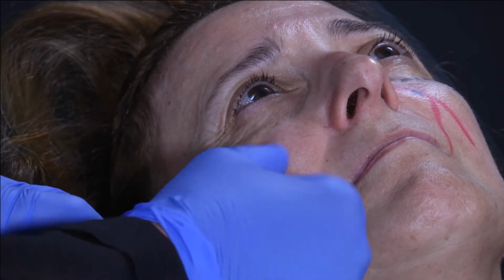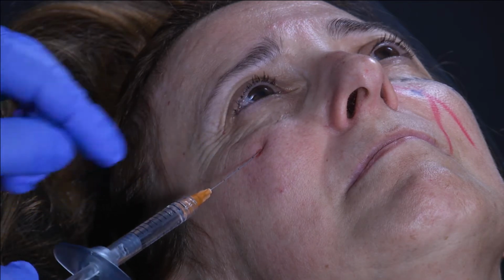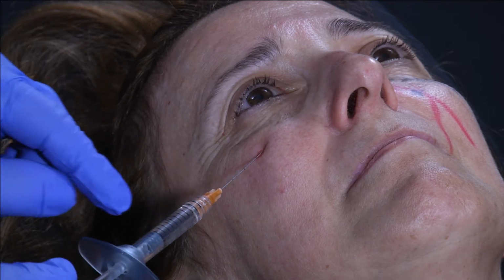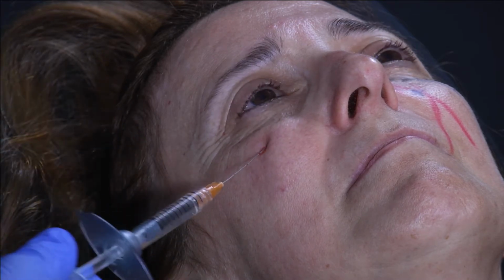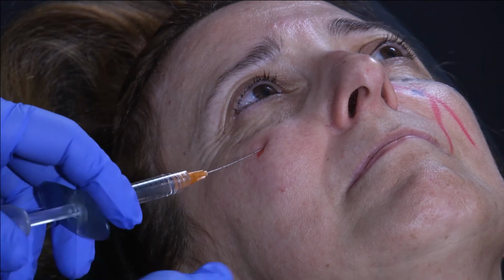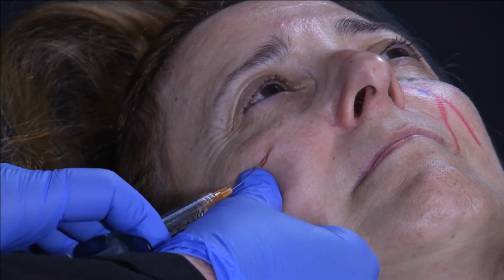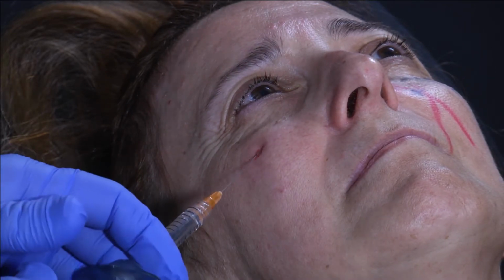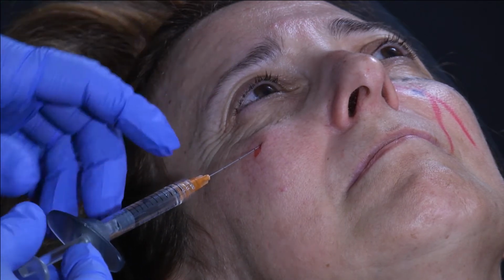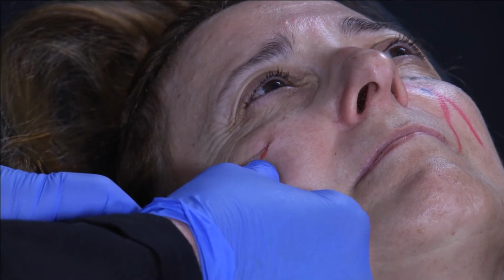I start to be in the tear trough. Here, because my cannula is 25 gauge, my cannula is in the axis of my syringe, and my syringe will have the direction to the tear trough. So here, I will go up, and my cannula slides on the bone, and like this, you see no effort. My patient has no pain, because I'm on the bone, and on the bone there is no pain. And I will inject slowly.